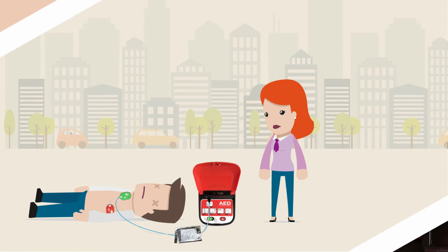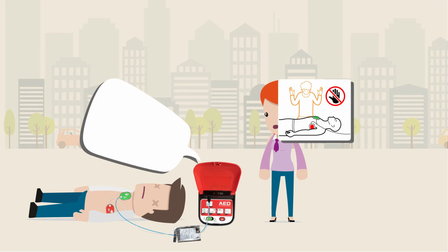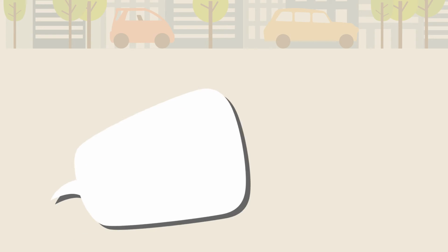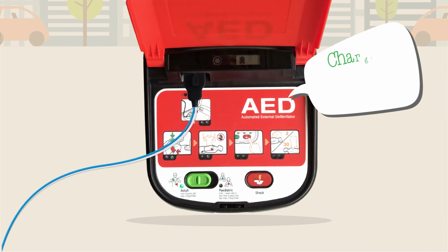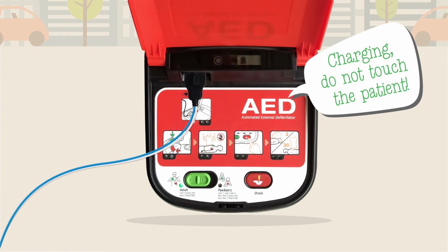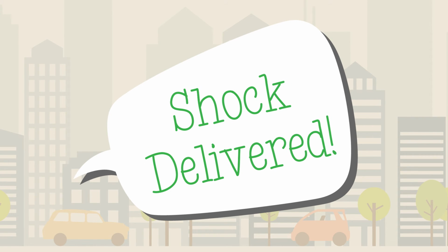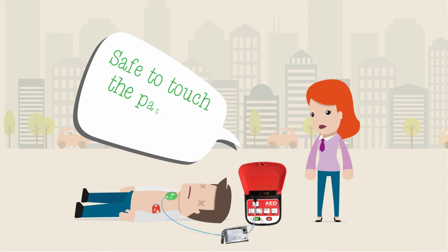Once the pads are applied correctly, the machine will say, analyzing heart rhythm, do not touch the patient. If a shock is required, the unit will say, shock advised, charging, do not touch the patient. When the AED is ready, it will tell you to press the red flashing button now, deliver shock now. The unit will tell you when there has been a shock delivered and when it is safe to touch the patient. You can now begin CPR.